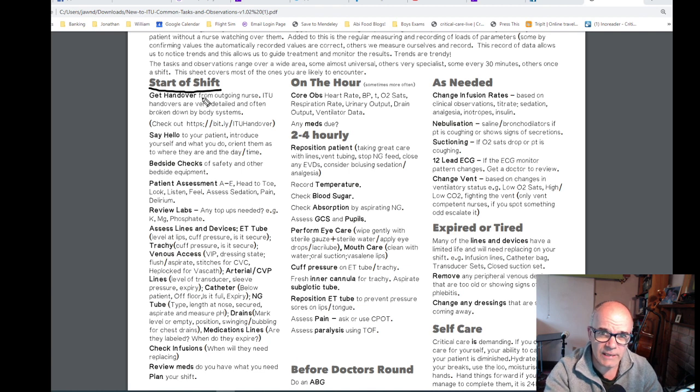Are there any chest drains in? So the chest drains, they could be left and right chest drains. If they are in, you need to make sure that they've got a fluid level in, which is covering the end of the tube. Otherwise, the patient's just going to be entraining air into their chest, which we don't want to happen. I have seen incidents of chest drains without any fluid in.